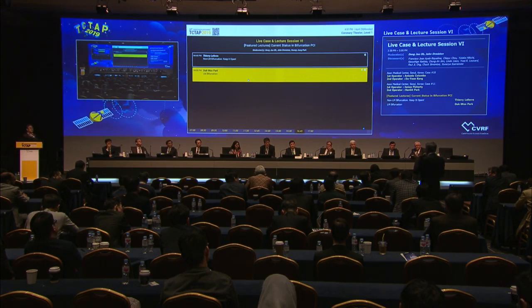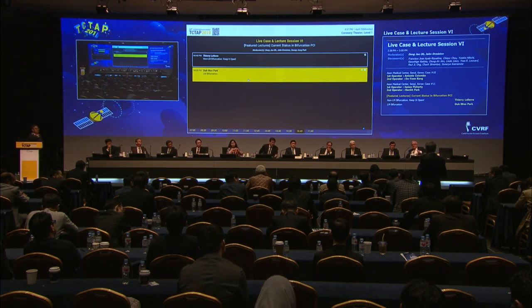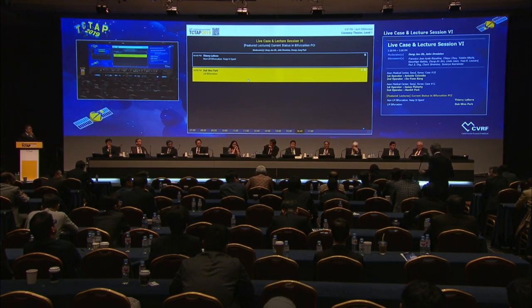If you don't do a DK crush, you will end with a kissing in 80-85%, no more. If you do a DK crush, you will end with close to 100% of cases with the final kiss. So this is very important. I'm not a fan of DK crush, but I think if you use a crush technique, it should be a DK crush technique.